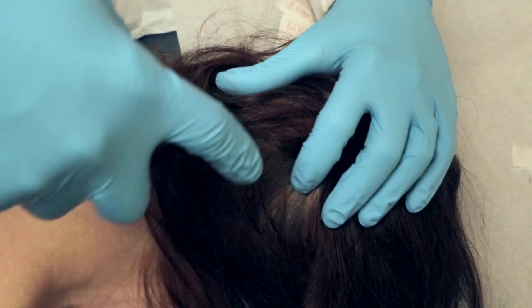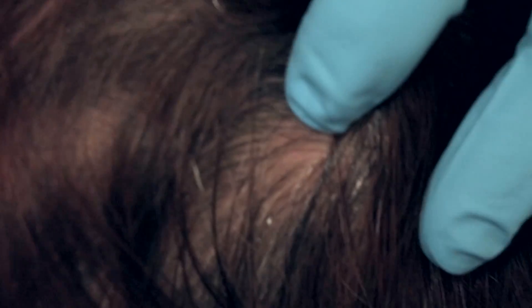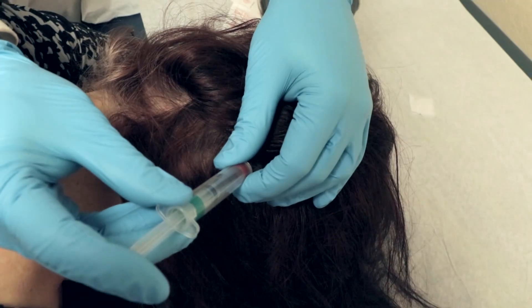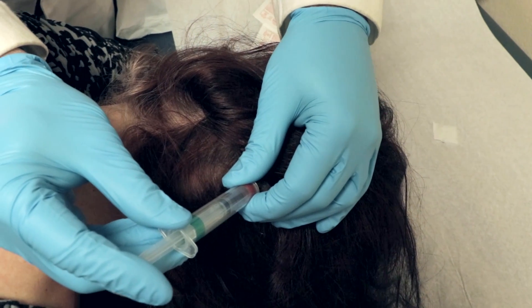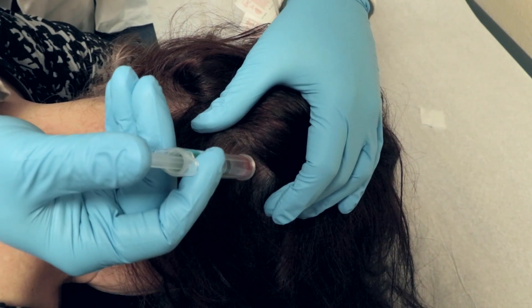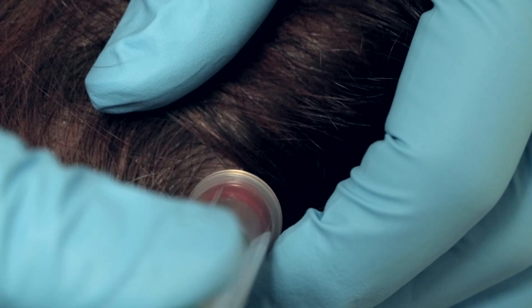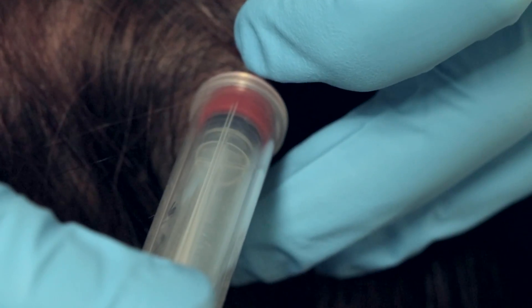We'll spray a little ethyl chloride to make it cold, then give the shot aiming upward toward the spot — drawing back to make sure we're not in a blood vessel, then going ahead and administering. I'm putting in 2 cc's of lidocaine with epinephrine plus 0.2 cc's of sodium bicarbonate, and fanning it a little by pulling out and redirecting. This is the greater occipital nerve on the right. I'll massage it in.